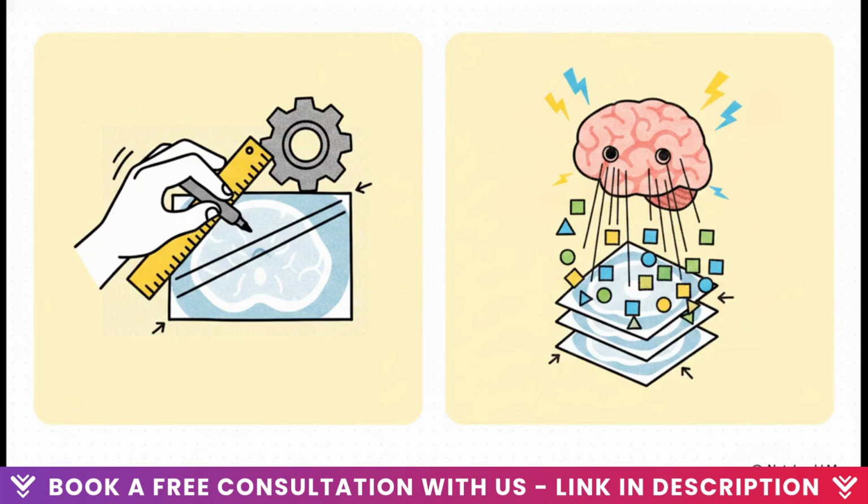And this brilliantly illustrates the massive paradigm shift in medical imaging. I mean, old-school computer imaging was entirely rule-based and physics-driven. Engineers had to manually code edge detection algorithms and explicitly tell the computer exactly what shapes to look for. But next-gen vision? That relies on deep learning. It uses automated feature extraction. We don't actually tell the network what a tumor looks like anymore. We just give it the data, and it learns the underlying patterns entirely on its own.